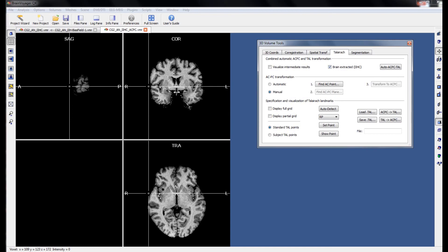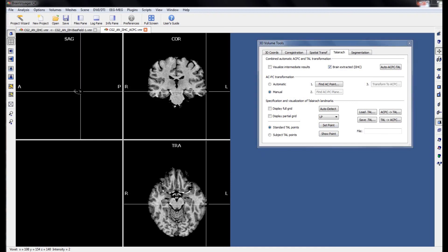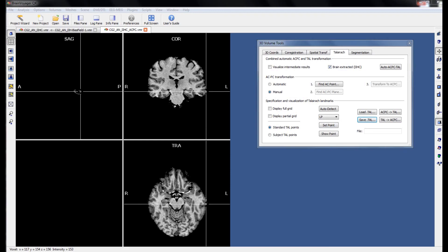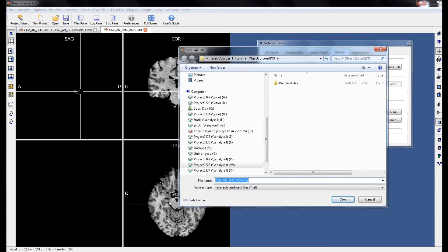The final two points are the rightmost point in the sagittal window in which cortex is visible, and also the leftmost point in the sagittal window in which cortex is visible. Once we are happy with our landmark points, we can save them.